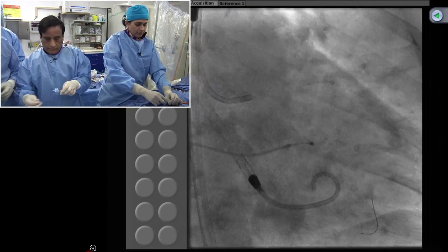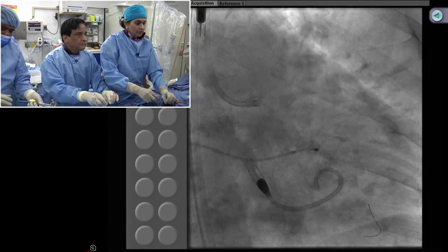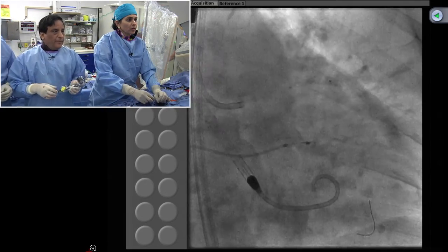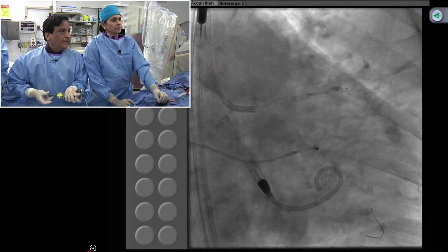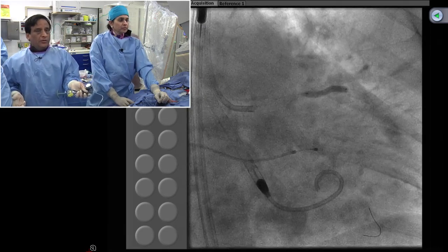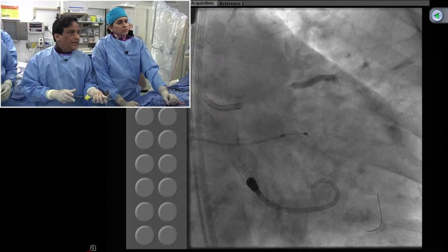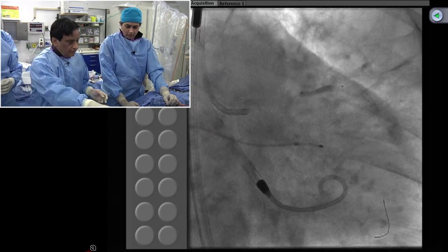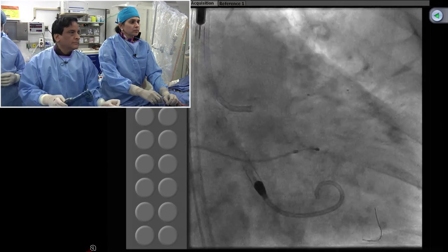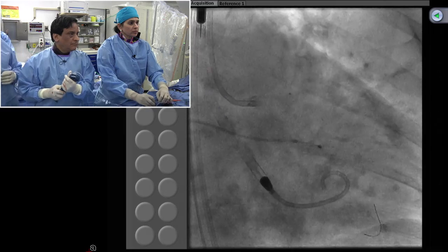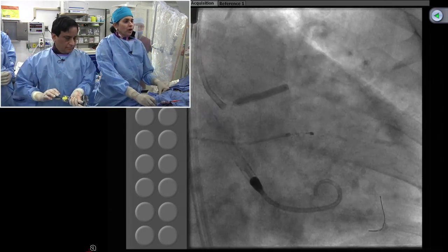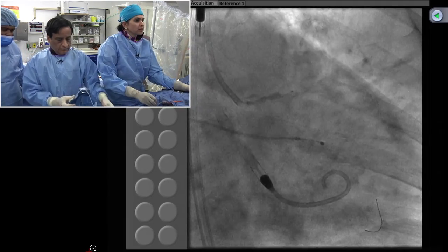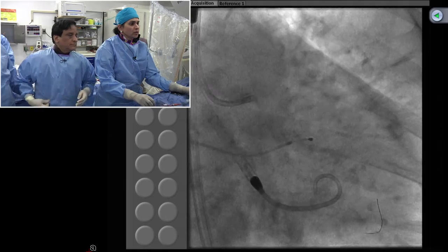By doing rota of that distal left main and ostium, you'd have less plaque shift into the circumflex — good point. And you see how hemodynamically stable the patient is — that takes a great deal of burden off the operators. This is a perfect example where Impella support allows you to do as much as you can and as much as you should. Look at this now — at 10 atmospheres, the 3.0 balloon has fully expanded. Being done on the rotor wire proves you don't need to go with a 1.75 or 2.0 at this point.